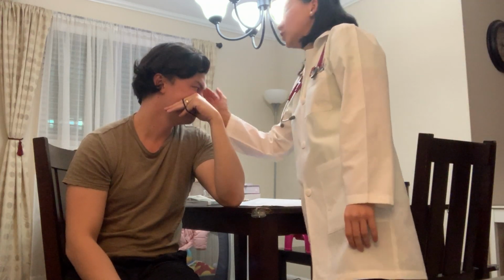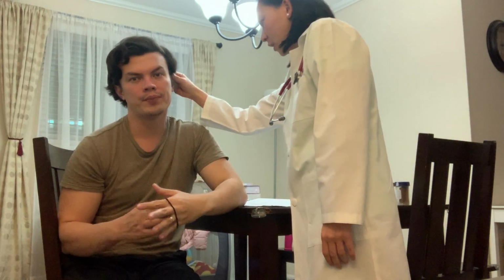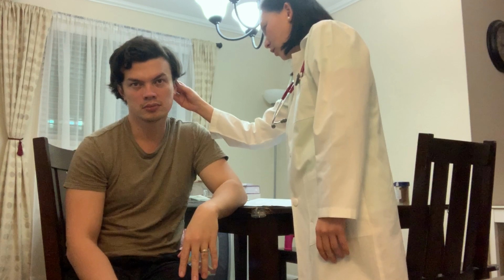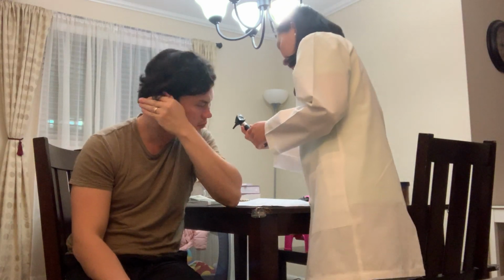Of course, so first thing we need to do is inspect, making sure the external parts of the ears have no signs of inflammation or infection, no deformity or anything like that. And again, using our otoscope, we would check.